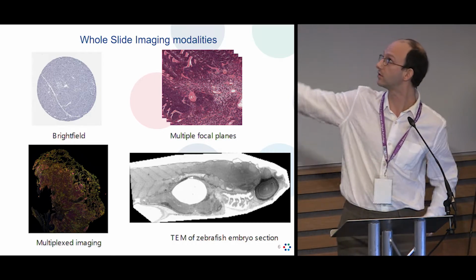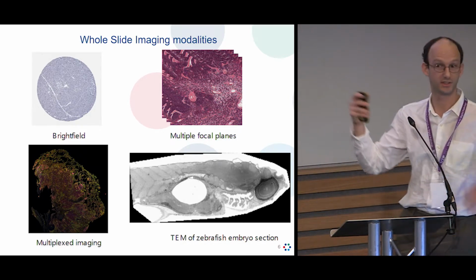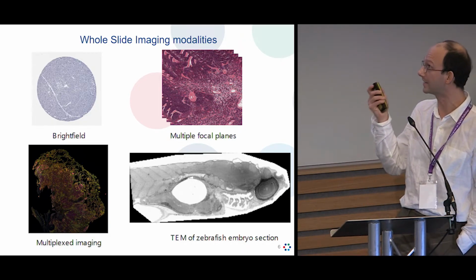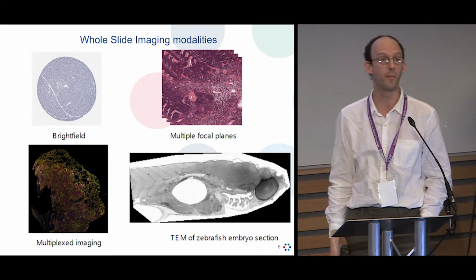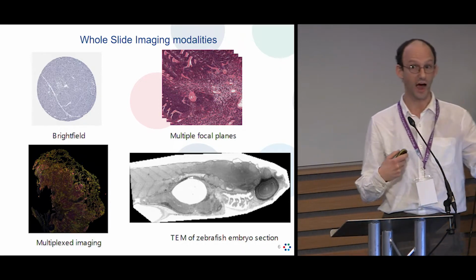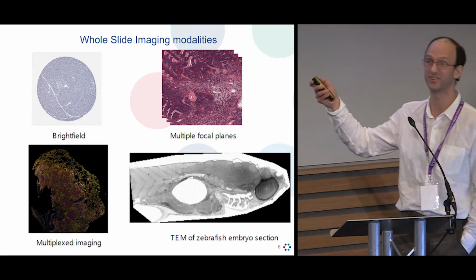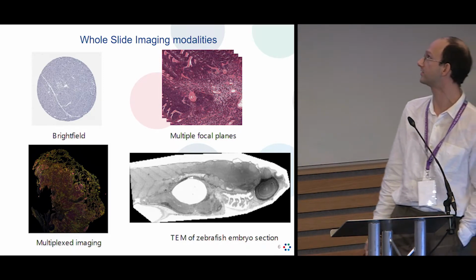So you've got the classical bright field tissue images. We've seen a lot of that. This can be expressed as different Z-stacks. But what we've seen growing, especially in the last years, is the arrival of multiplexed imaging. So that's fluorescence imaging, where you have lots of hyperspectral planes. You have now 2 to several tens or even hundreds of channels that need to be analyzed that way.